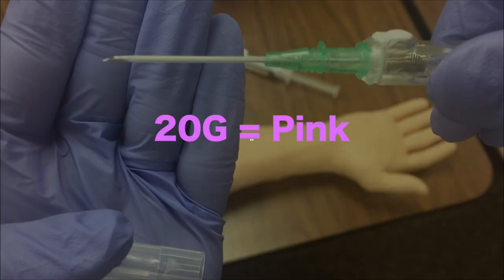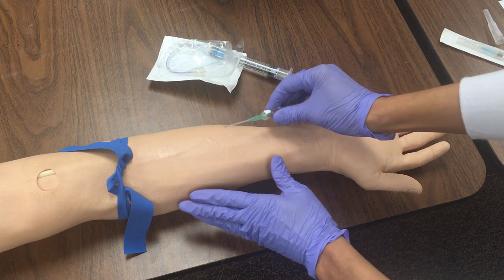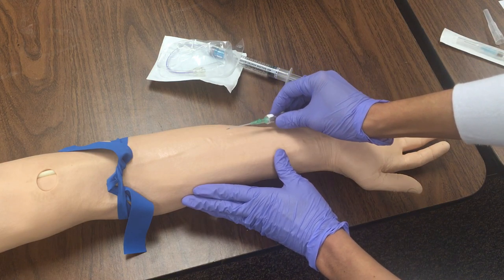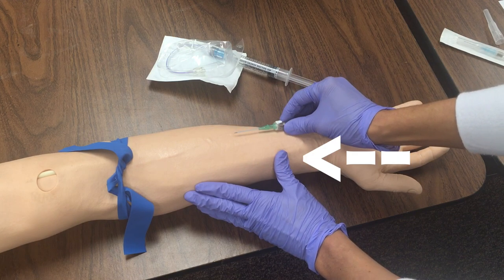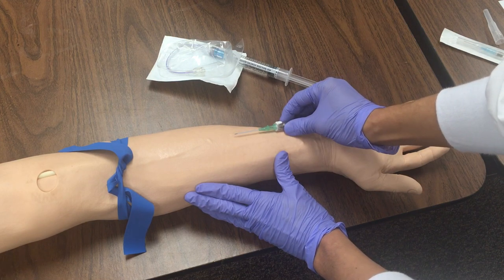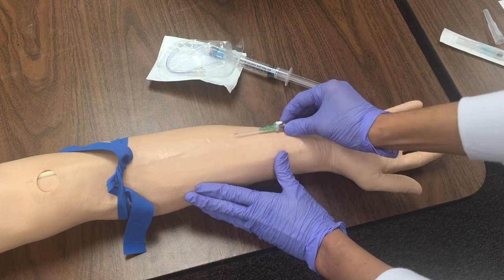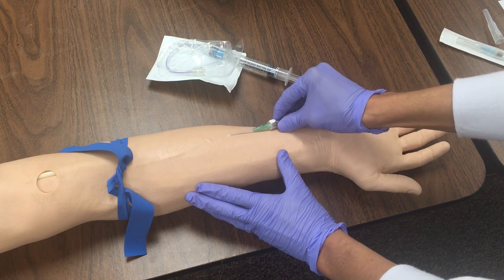I usually use on the floor either a 20 gauge, which is pink, or a 22 gauge, which is blue. But to get through the mannequin arm it's actually really challenging, so I'm using a larger needle, which is an 18 gauge. Select your site. What I look for is something that has a hose-like feeling, and if I can see it that's even better. Sometimes I pull back the skin right there to give a more taut environment so I'm able to insert the needle a little bit easier. Tell your patient to take a deep breath in on the count of three — that will help the patient and their blood vessels relax.